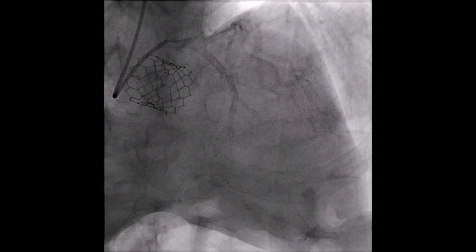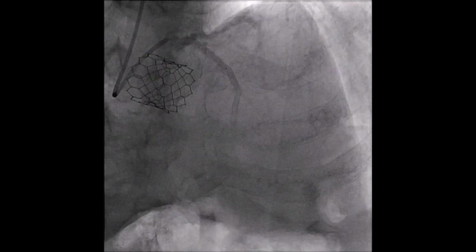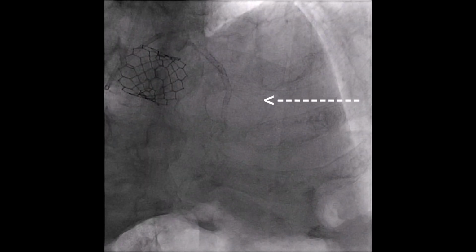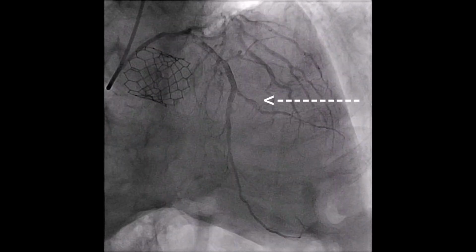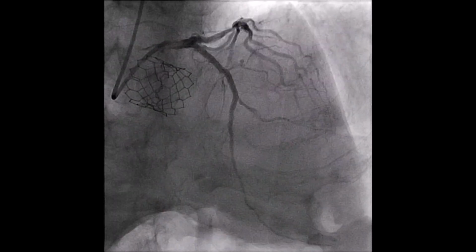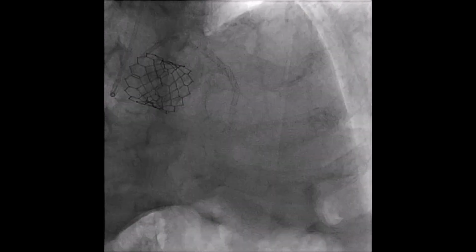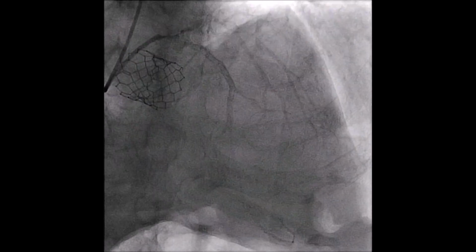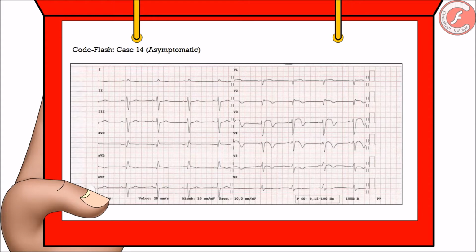At this point, some might wonder, why was the secondary branch not treated with a stent, taking into account that there is plaque and dissection of the vessel at the proximal level? And the answer is very simple. The flow is good, and the vessel is not very developed, which is why implantation of a stent is not recommended. In this way, with the artery open, the left bundle branch block persists, but the ST segment elevation progressively decreases, and the patient's pain disappears.